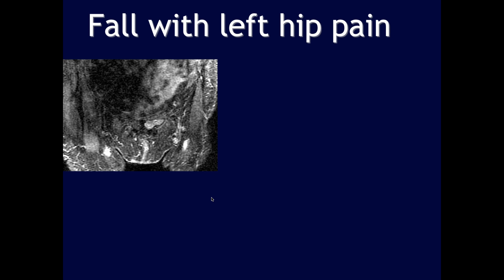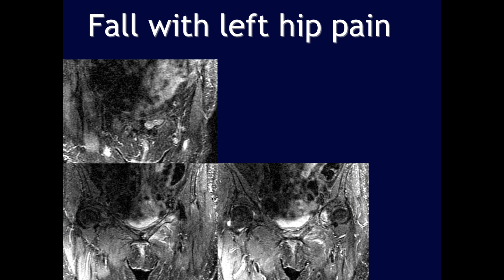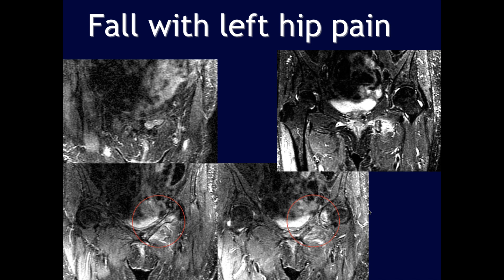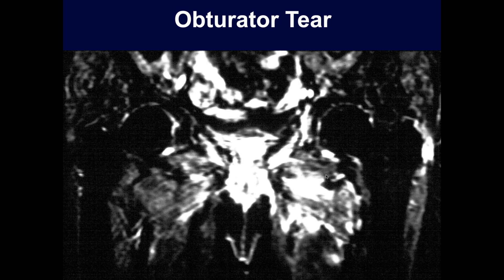A case of fall with left hip pain. Imaging appears anterior, showing edema within the left superior pubic ramus with a fracture extending through the ramus consistent with acute fracture of the superior pubic ramus. It is unclear whether there is an additional inferior pubic ramus fracture.